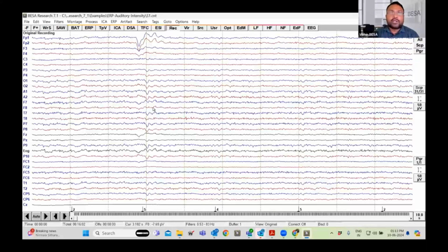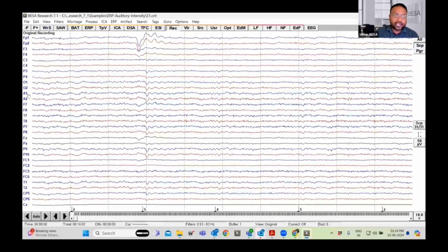Okay, now during this initial inspection, when you find artifacts or some bad channels, how do you deal with it? One way of dealing with it: suppose you are seeing that this channel, O1, which you see here, is an artifact. It is not artifactual here, but just suppose that it is an artifactual channel. Then you may just right click over the channel and define that channel as a bad channel, if it is bad throughout.